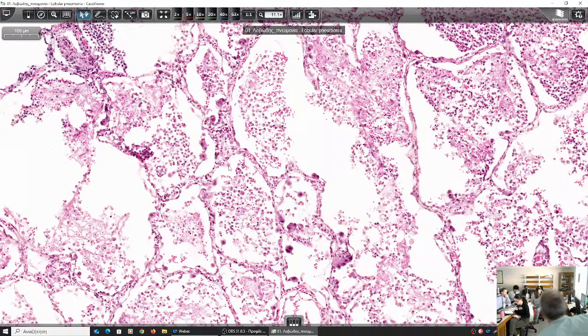It's easy. No worry. Because there are some cells here that we identify in the tissue and they tell us what to give to the patient. Sit, please. What's your name? Edmund. All right. So, are there any cells, Edmund, here that you would like me to describe? What do you think?